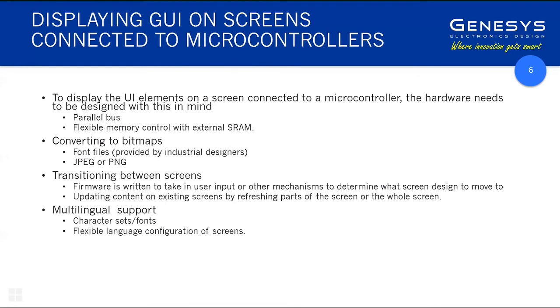What you're basically saying is that there's nothing between the microcontroller and the LCD screen. Like in a mobile phone, you've got all the proprietary companies', Samsung's or Apple's, software in between you and the screen that you have to deal with and get through. Whereas this is just a straight path to the screen, so there's no SOUP.